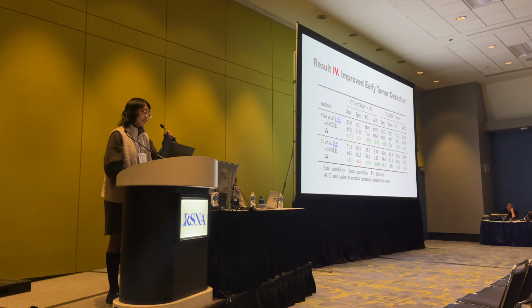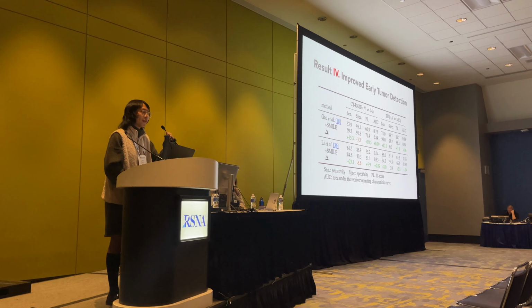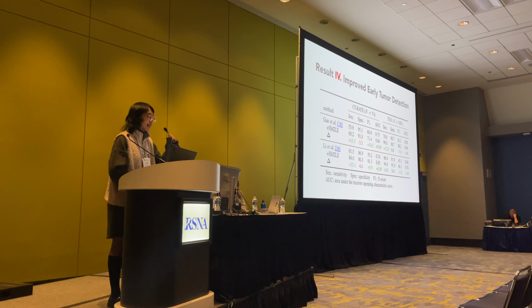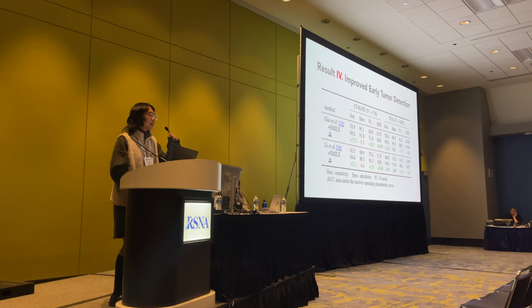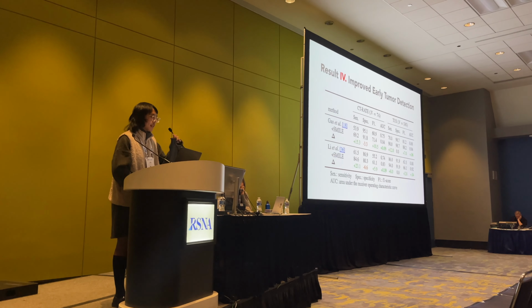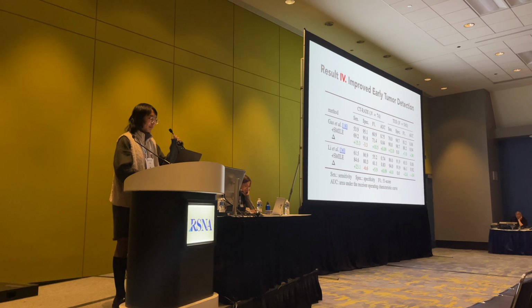For the downstream task, this is the shining point of the project: we did improve the non-contrast tumor detection results by enhancing the non-contrast scans to the contrast phases. Here, we compare on the pancreatic PDAC dataset with 2 state-of-the-art tumor detectors. After introducing SMILE to enhance those CTs, we found that we get at most 20% in sensitivity, and overall 10% in AUC and F1 score, with some modest loss in specificity. Above all, this proves that it is working well in virtual settings and can detect tumors in this way.